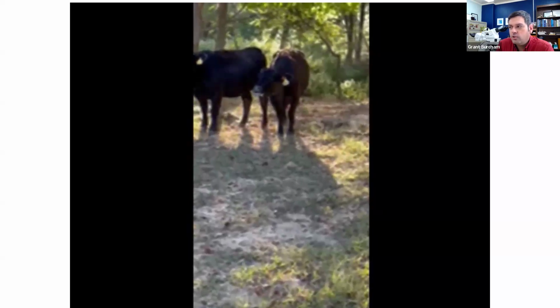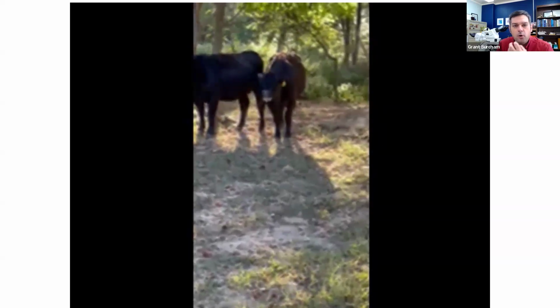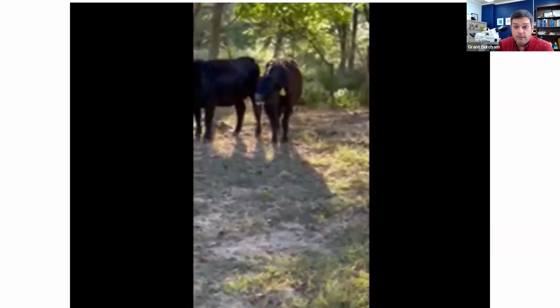It's a little grainy, but she is open mouth breathing. You can see that her mouth's open. And there's quite a bit of foam around her bottom lip there. So she's breathing very heavily. This animal died overnight, and the producer brought her to us to do an autopsy.